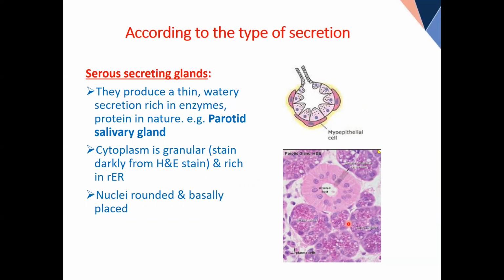Normally, the nucleus stains purple or blue because it is acidic. It is stained by basic dye; it takes the color of basic dye. Good. Cytoplasm in general takes the pink color because it is acidophilic, because of the proteins in the membrane. So it is stained by acidic dye. Now, sometimes there are cells especially designed for protein secretion.